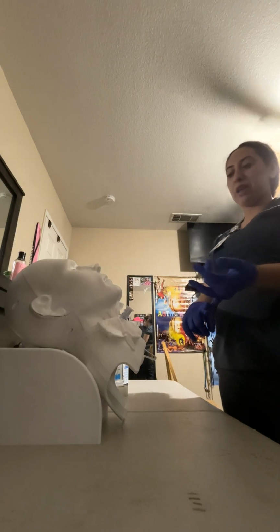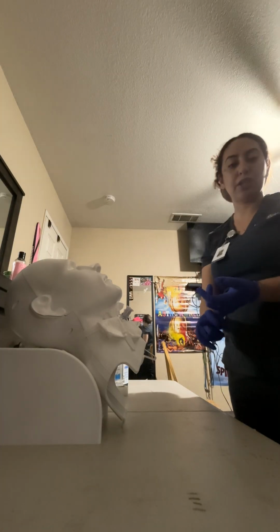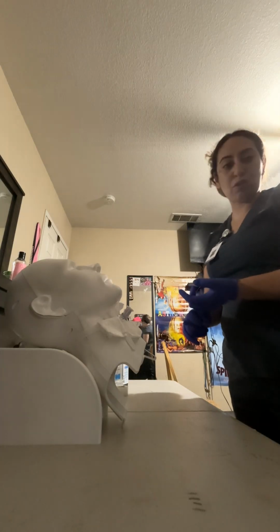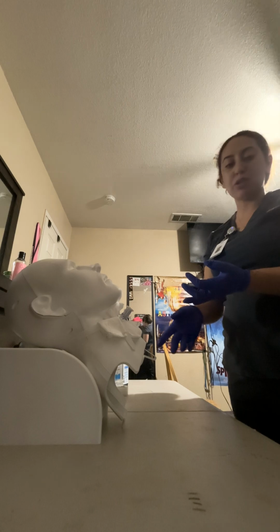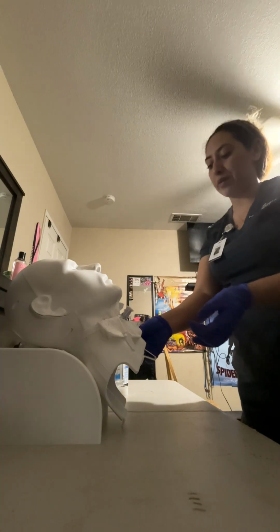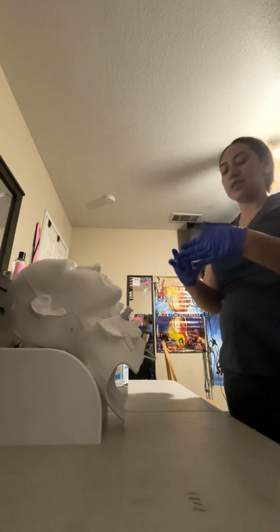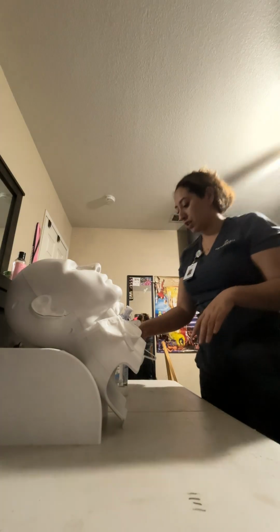At this time, I have rechecked my patient's vital signs as well as rechecked that his oxygen levels are within normal limits. So my patient's vital signs are stable. The pulse ox is reading that he is in the high 90%. We have no respiratory issues. At this time, I'm going to go ahead and take my gloves off. I'm going to wash my hands.